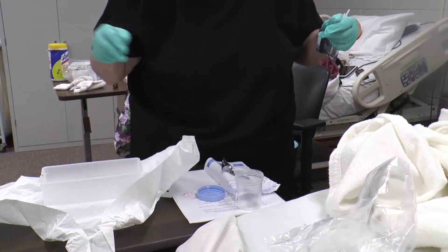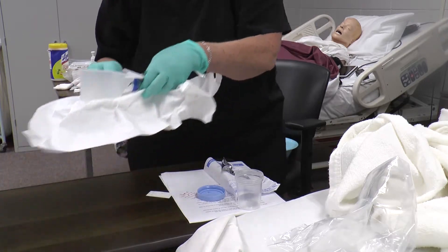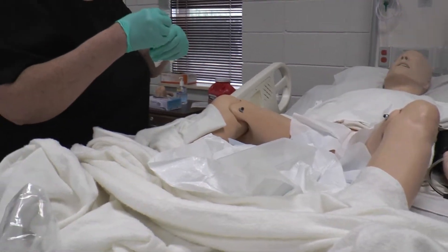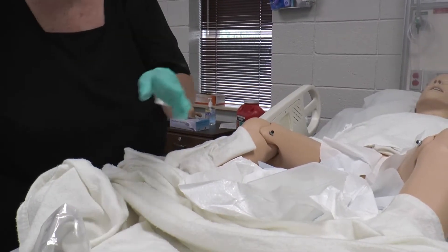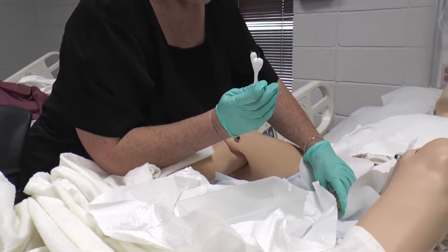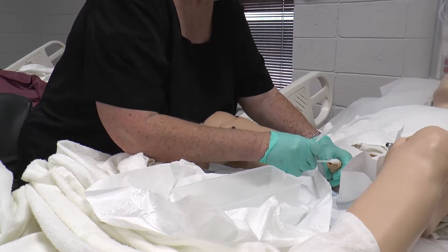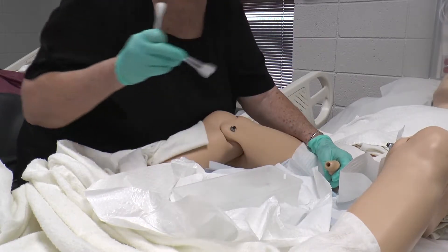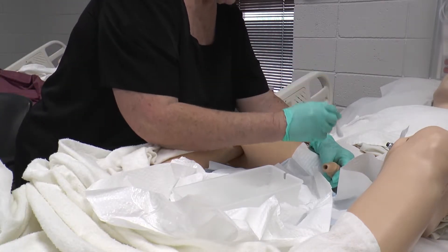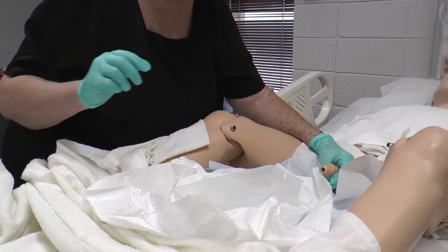Trash the packaging. Still sterile, take the catheter by the side and set it aside. Now use your non-dominant hand to hold the penis down on the shaft, and starting from the meatus, clean one time around with each swab — first one around, then lower with the next one around, then last one close to the head. One time around only, don't circle back.